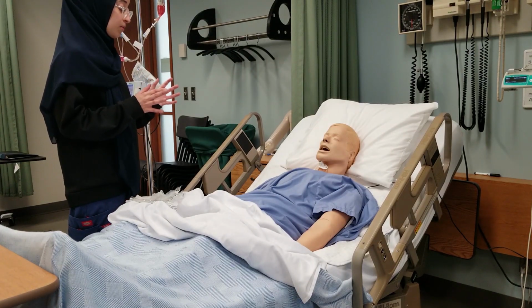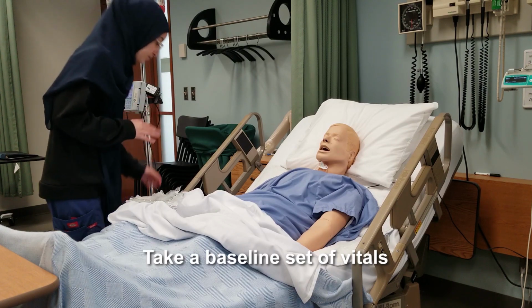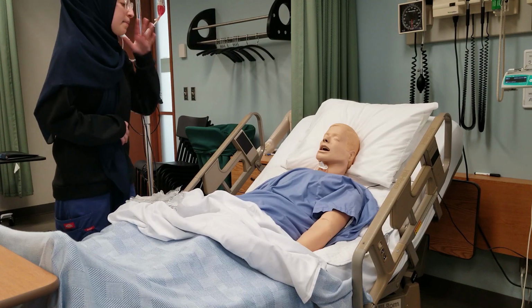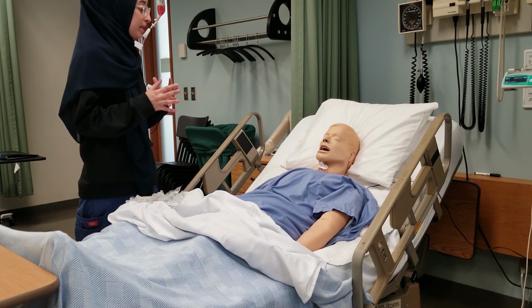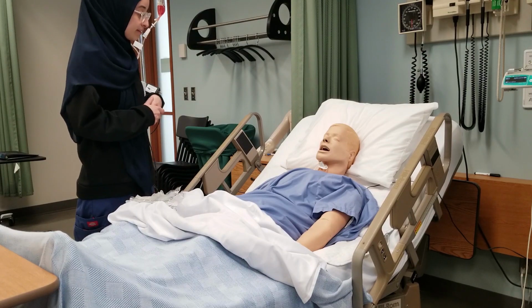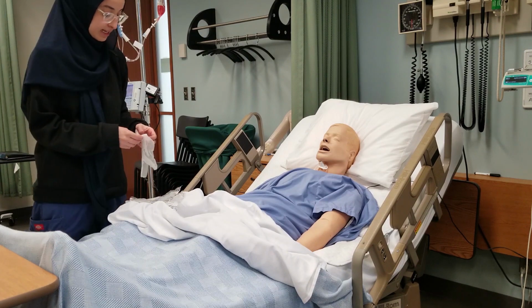I did want to take a first set of vitals on you just to make sure that nothing will change afterwards. Oh, sorry. Well, I'm going to put this at your bedside. That way, if anything happens, we can make sure that it wasn't something that was there before and that it's something specific to the blood. Okay? Perfect. All right, so I'm going to go ahead and get started.